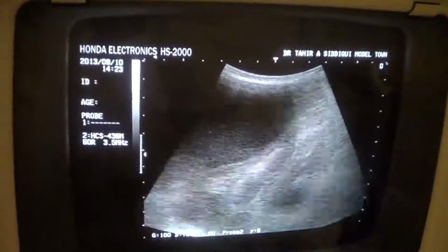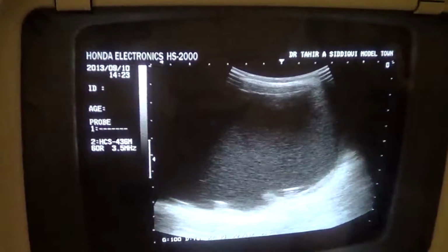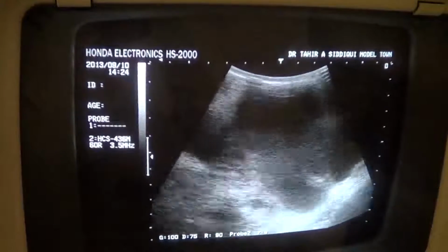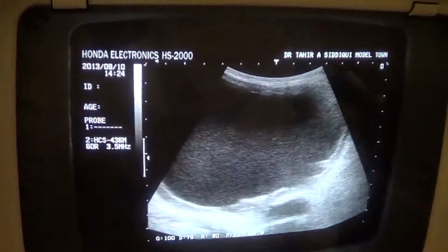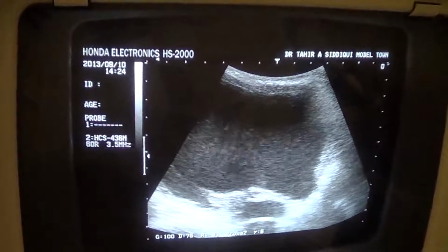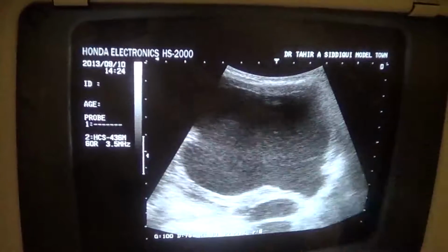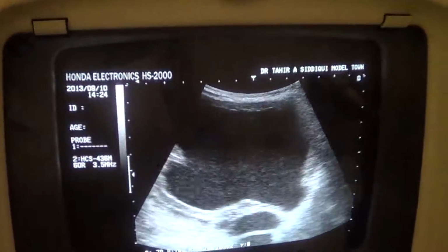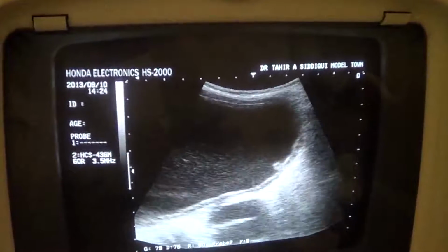These are in fact, this is the dilated renal pelvis, I show you, which is full of echoes. Both the pelvises are dilated. You see the movement of the echoes within it, filled with low level echoes. No calcification is seen. And this is the distal ureter.